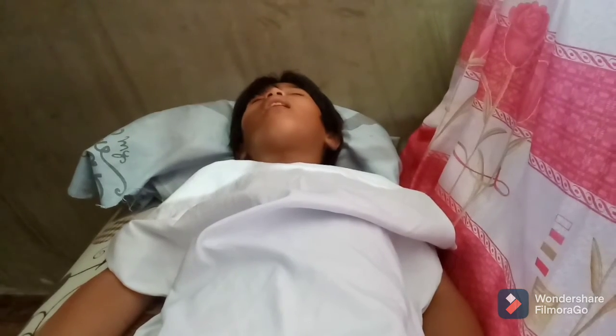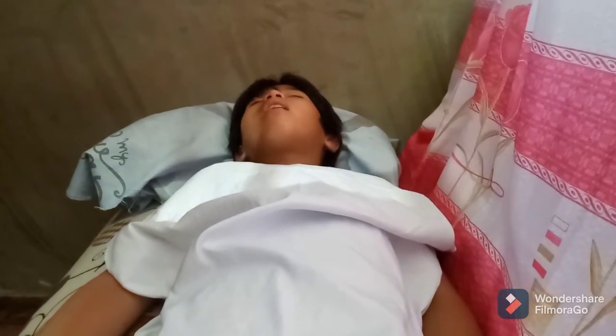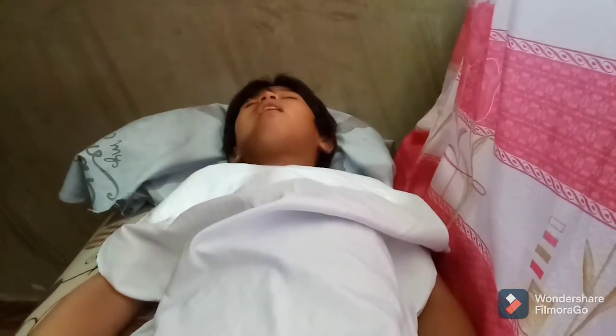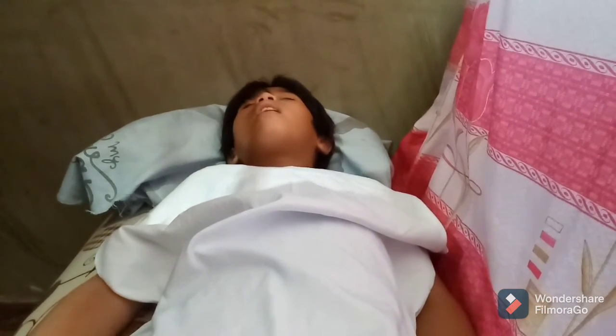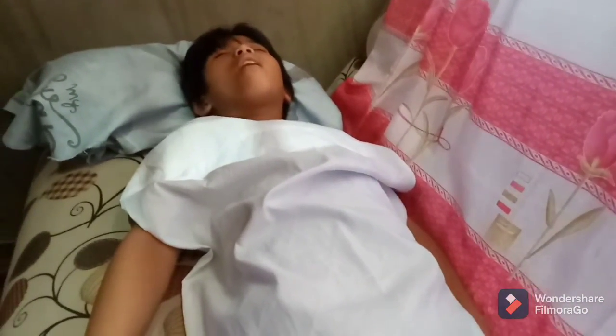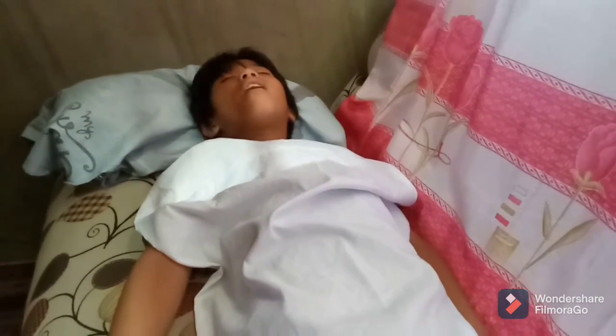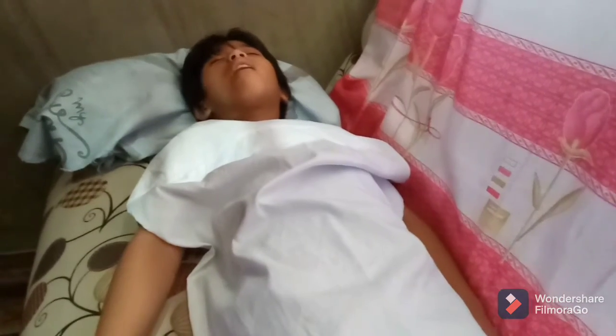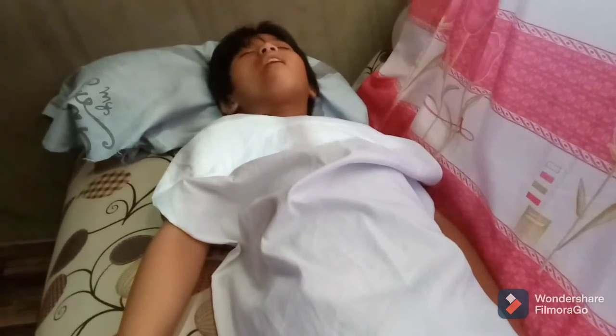The technical factors are an SID of 60 to 72 inches or 152 to 183 centimeters. The IR size is 8 by 10 inches in a lengthwise position. Always remember to shield the gonads of the patient because that is very radiosensitive.